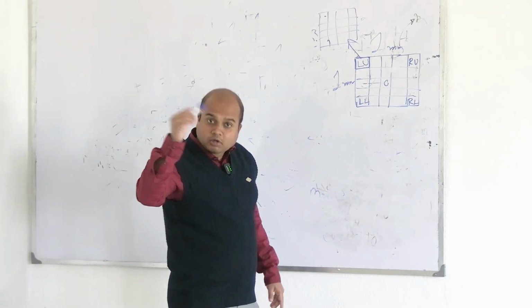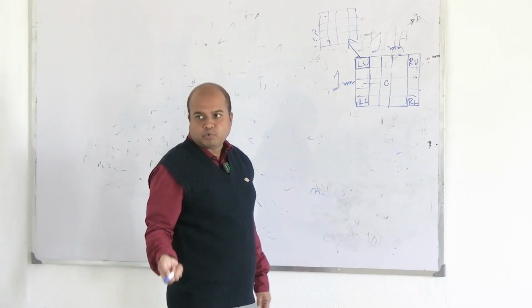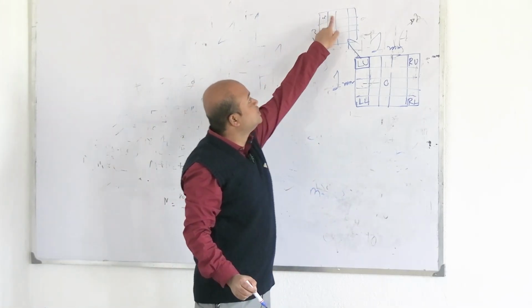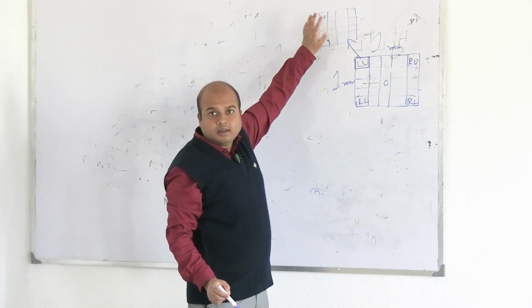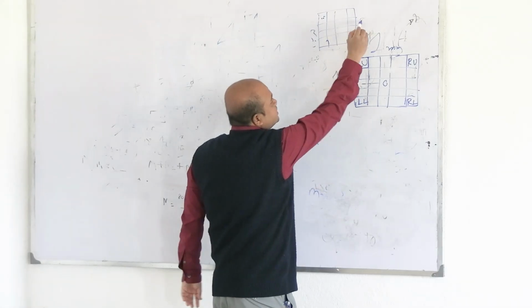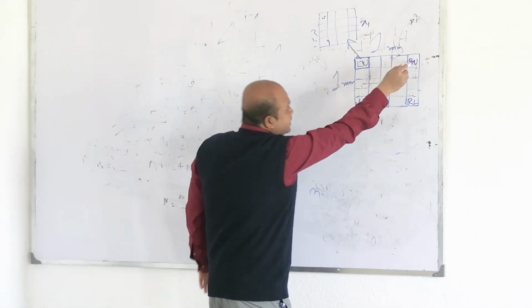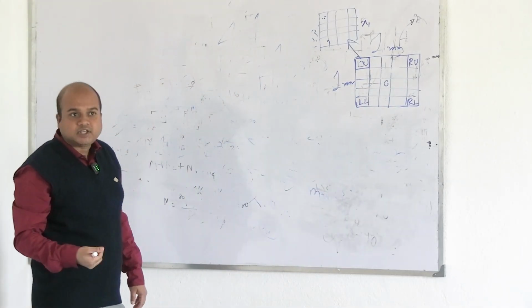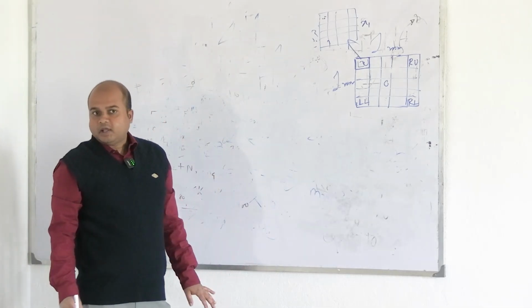So, the small RBC squares, or what is written as smallest squares in books, these squares are counted separately. So, 16 counted separately, right. By counting these 16, we write it as, say, x1. Again, inside this, the 16 are counted separately. And how? Density of cells is more.